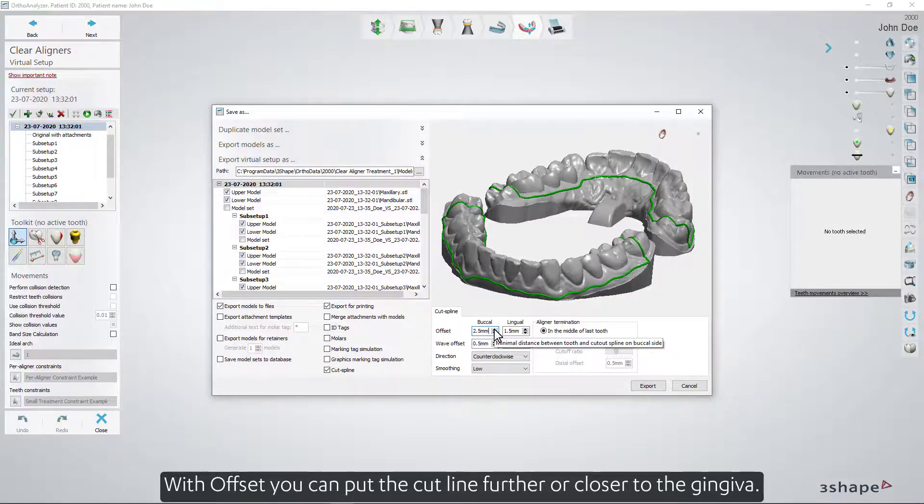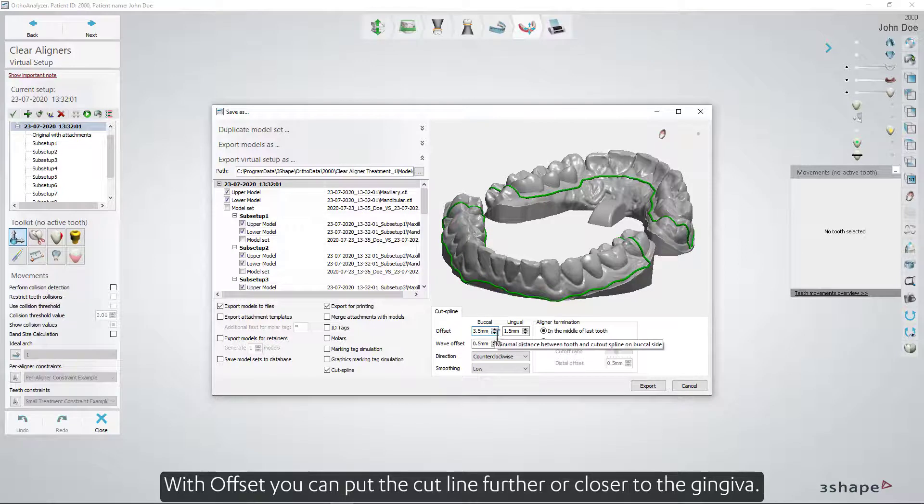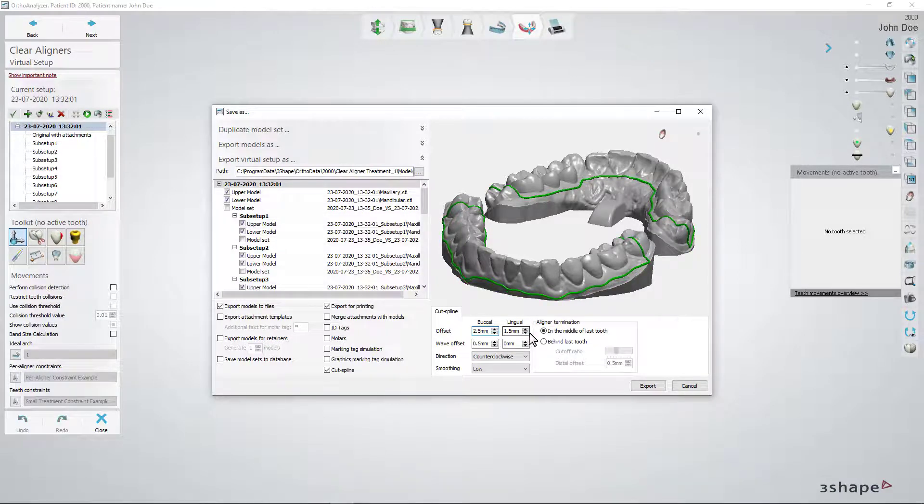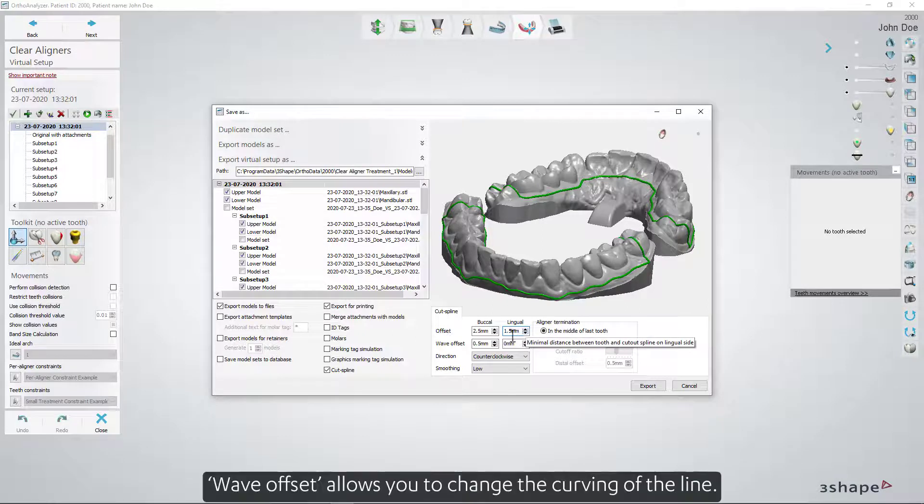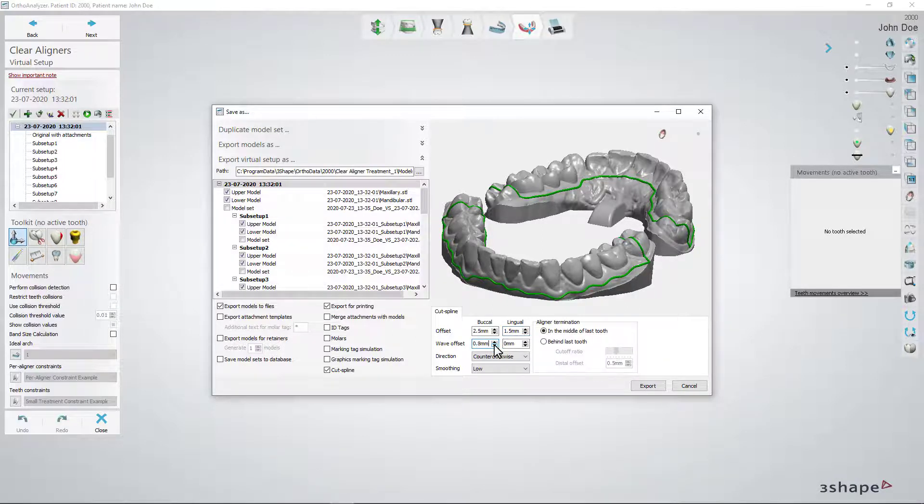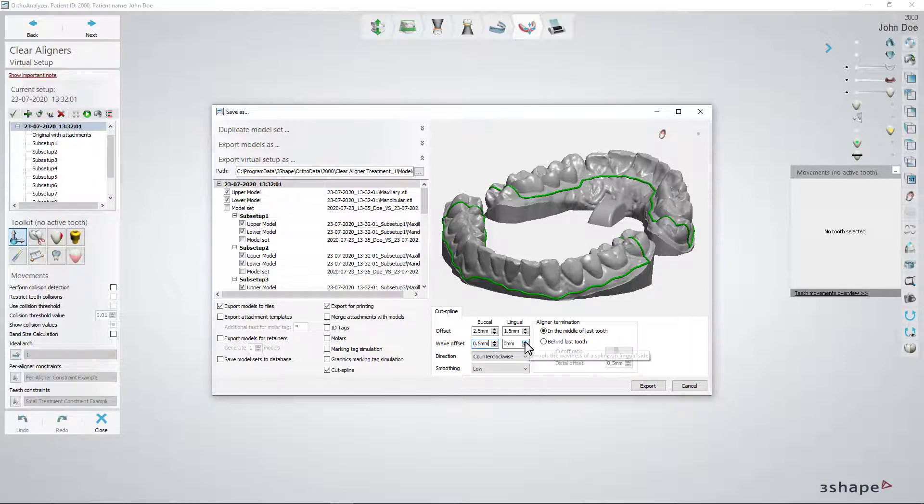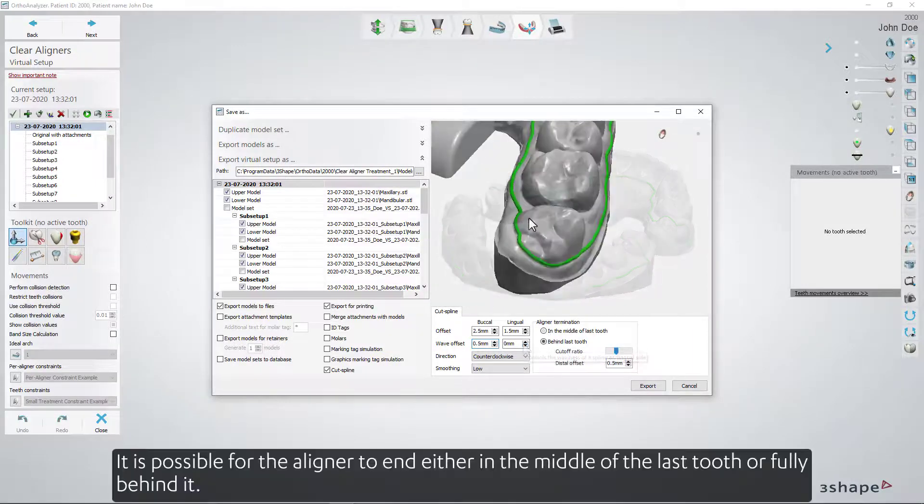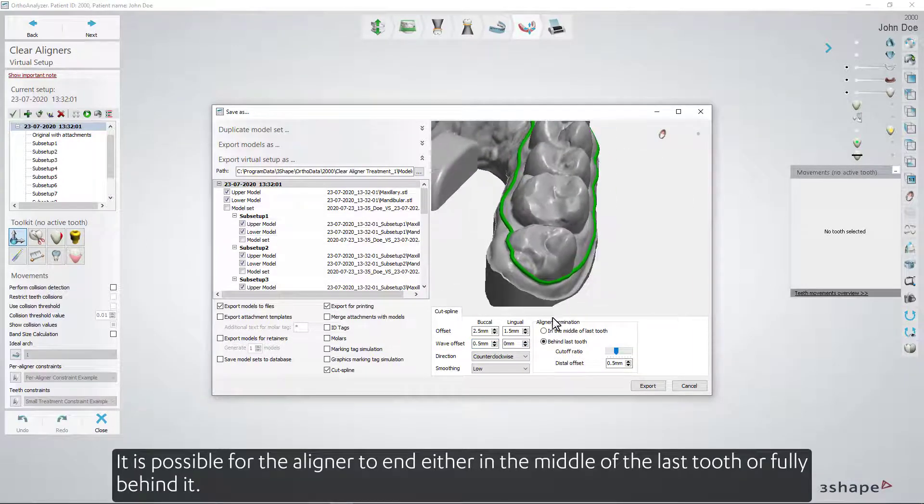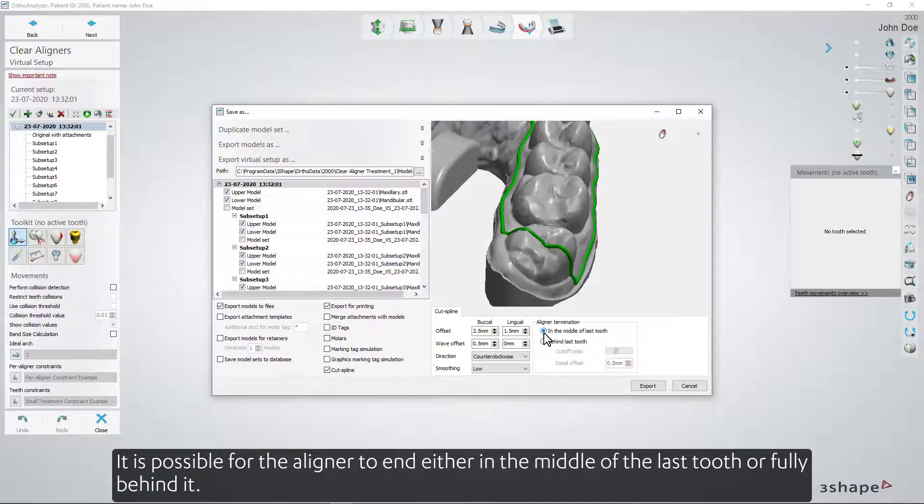With Offset, you can put the cut line further or closer to the gingiva. Wave Offset allows you to change the curving of the line. It's possible for the aligner to end either in the middle of the last tooth or fully behind it.